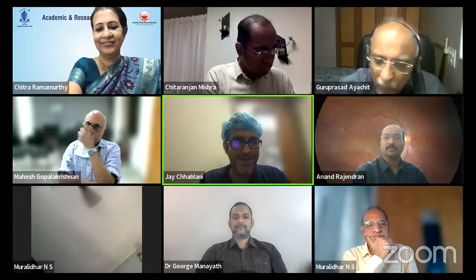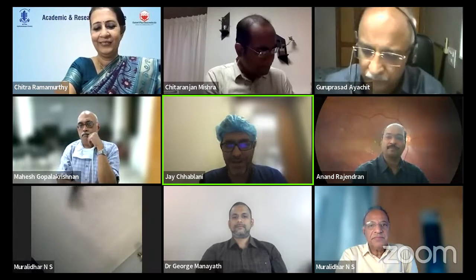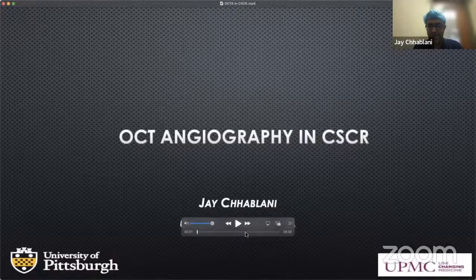Because I believe ARC is doing such a great job, and when we are talking about advanced imaging, I decided that we will just jump on to the OCT angio. I have recorded a video because of some time constraints, so I'll just go ahead and play the video. And if there is any difficulty in listening or it's not clear, let me know.